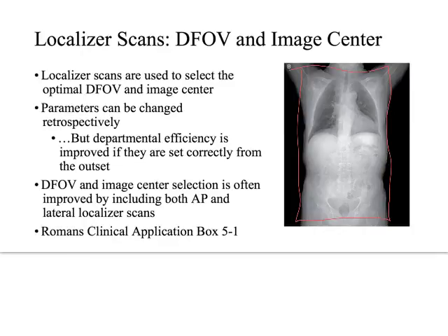It might have been in the scan field of view, so that information might be there in the scanner, but when the scanner generates the images, I will not be able to see that information.